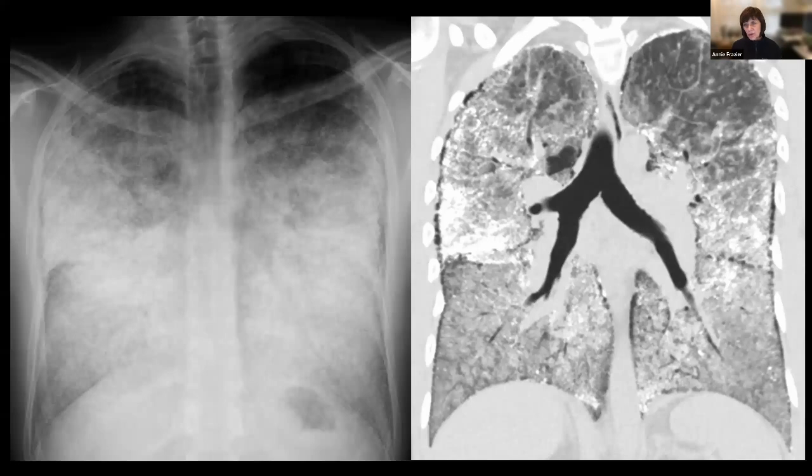We look at the coronal CT reformat, and you can see that there is widespread ground glass, I would say, in all five lobes that look centrilobular to me, with some periseptal sparing and juxtapleural sparing or cystic opacities there. Fine. Could that be periseptal emphysema? And then you also see more coalescent disease that is showing very high density calcification.